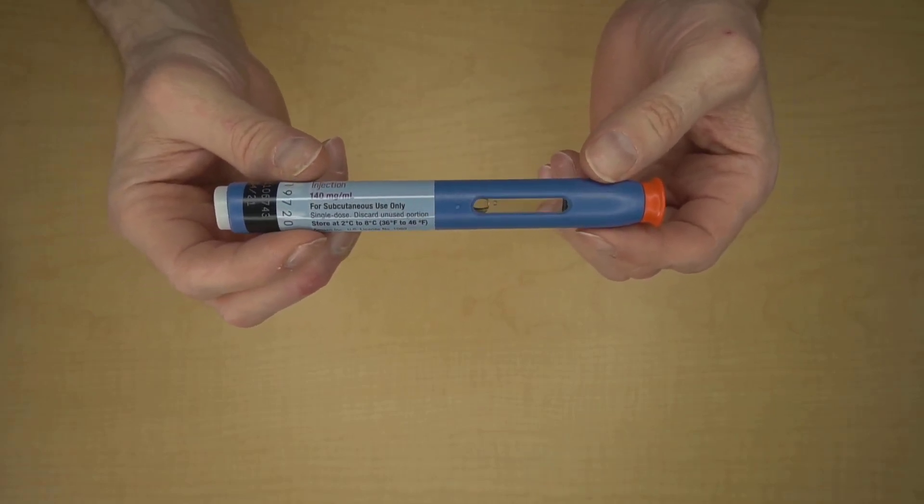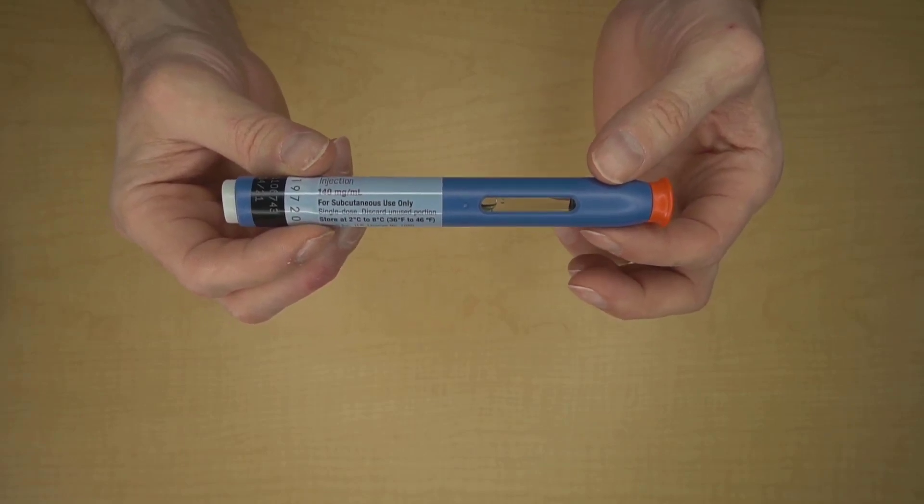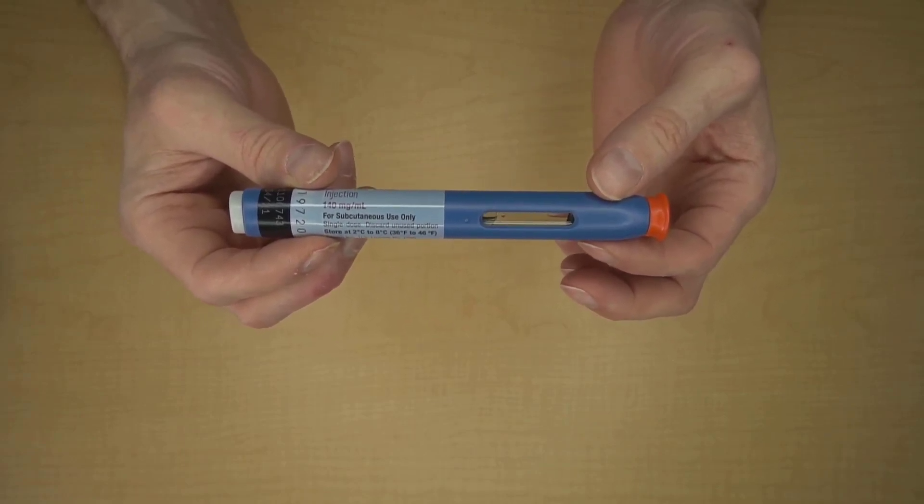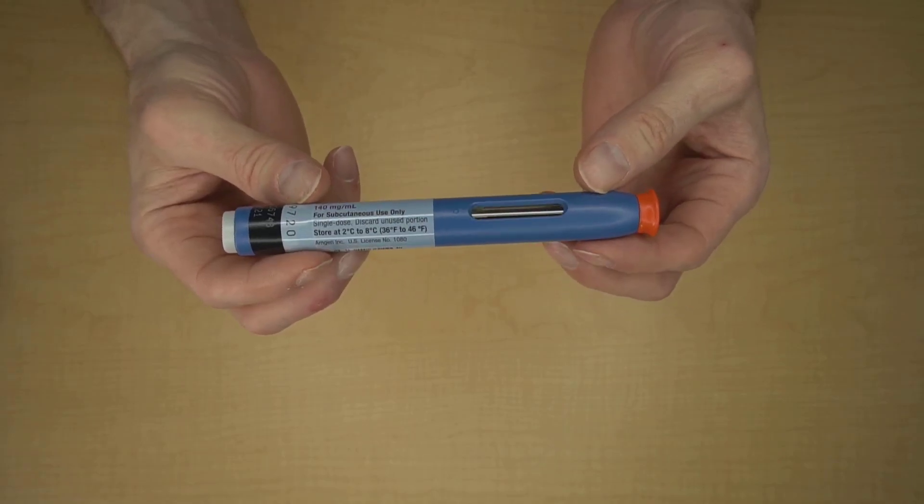If your Amovig auto-injector doesn't look like this, don't use it. Use a different one and just call your doctor or call Amgen, and they should be able to arrange a replacement.